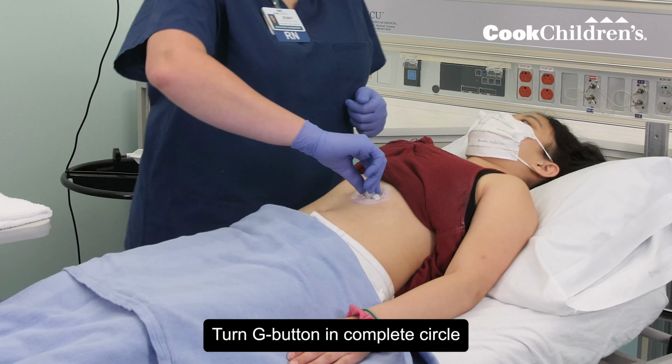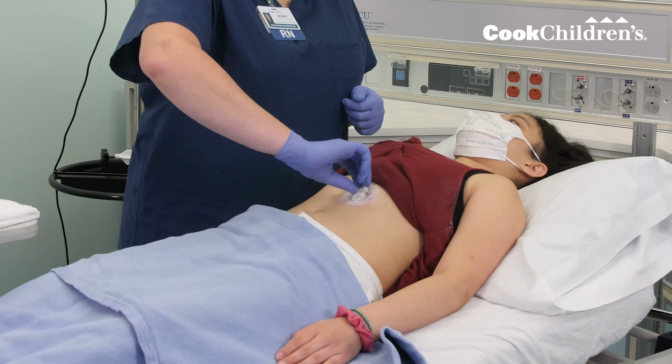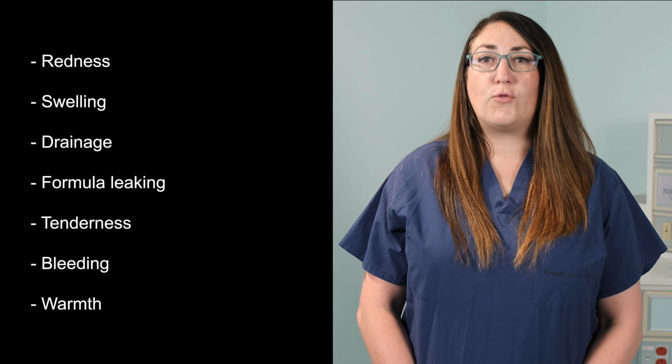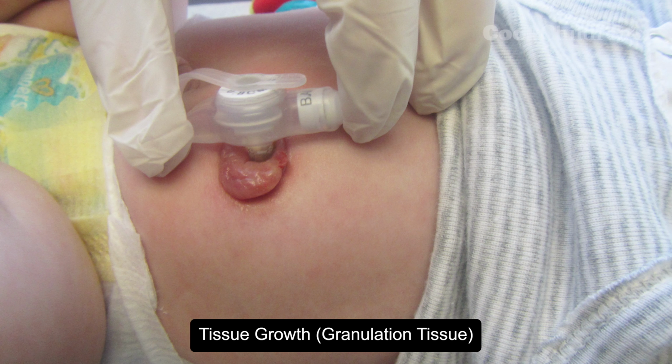Then, turn the G button in a complete circle in order to check the skin all around the site. Look for crusting, redness, swelling, drainage, formula leaking, tenderness, bleeding, warmth, or tissue growth. Tissue growth is also known as granulation tissue.